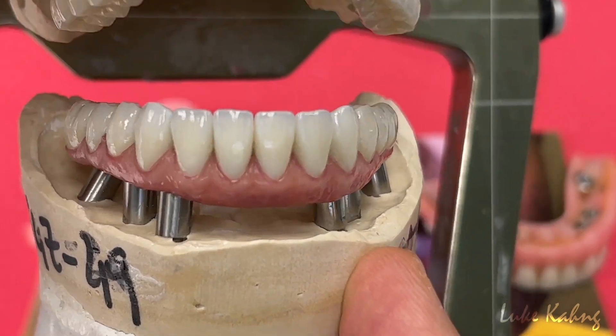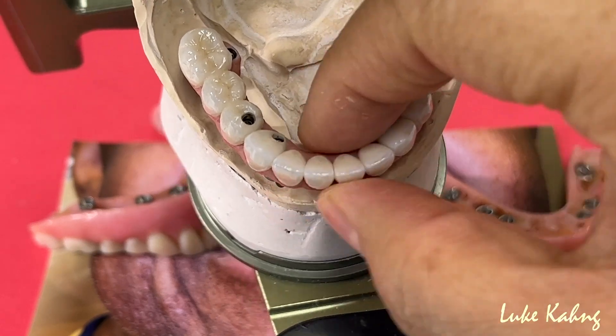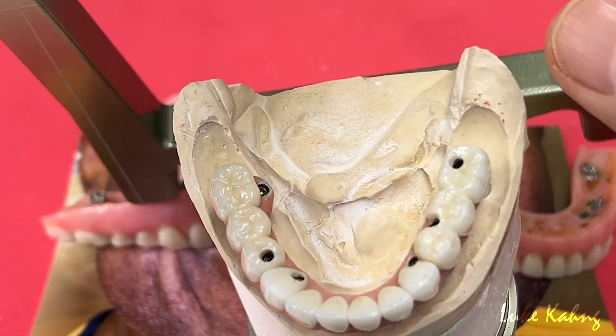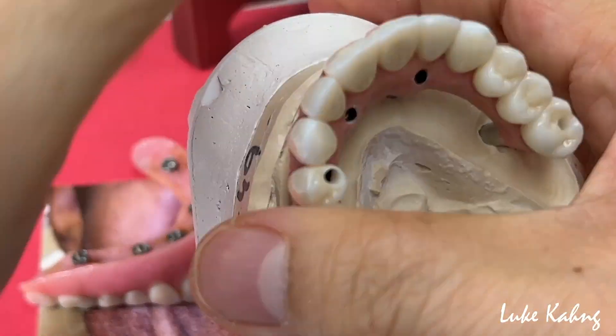11 implants — it's long span. We overcome the long span challenge. Very thin here. It's not only this — it's upper, and it's really thin as well.